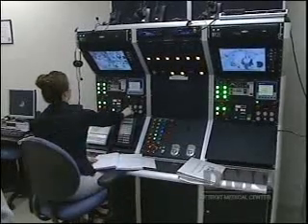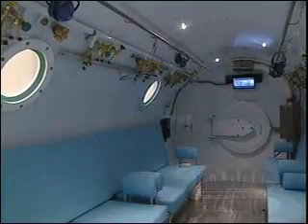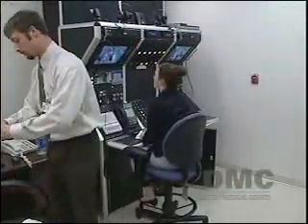And although there are some things that we still don't understand about the hyperbaric chamber, the good news is it works. The body, when it senses an area that has no oxygen and an area that has very high oxygen, tries to build blood vessels from the very high oxygen area into the area that has no oxygen. We don't know exactly why that occurs, but the body senses that area that has no blood flow and tries to build new blood vessels down into that area that has no blood flow. And one of the main things about it is that with this therapy, we can grow new blood vessels in tissue. We can make new blood vessels grow into tissue that have been destroyed by x-rays, been destroyed by atherosclerosis, and all kinds of things, and make new blood vessels grow in there and heal things.